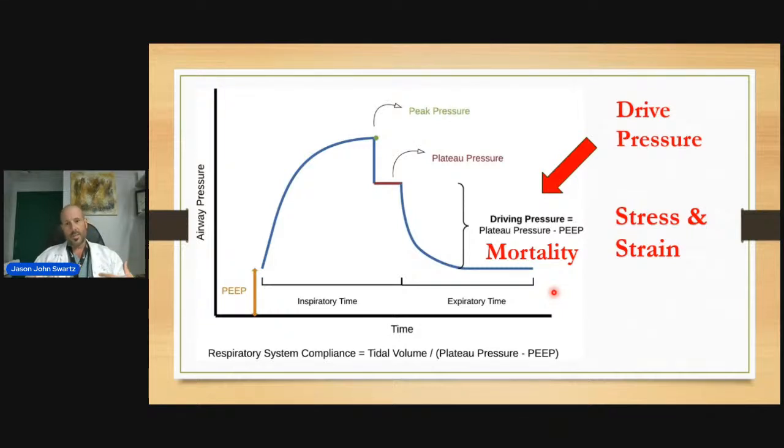And when we suddenly see changes in these mechanics, that's an indicator, at least at my hospital, to say, okay, things are getting more complicated. We need direct visualization of the distribution of ventilation within the lungs. So let's put on the electrical impedance tomography, the PulmoVista, and let's really individualize. Let's make the adjustments.